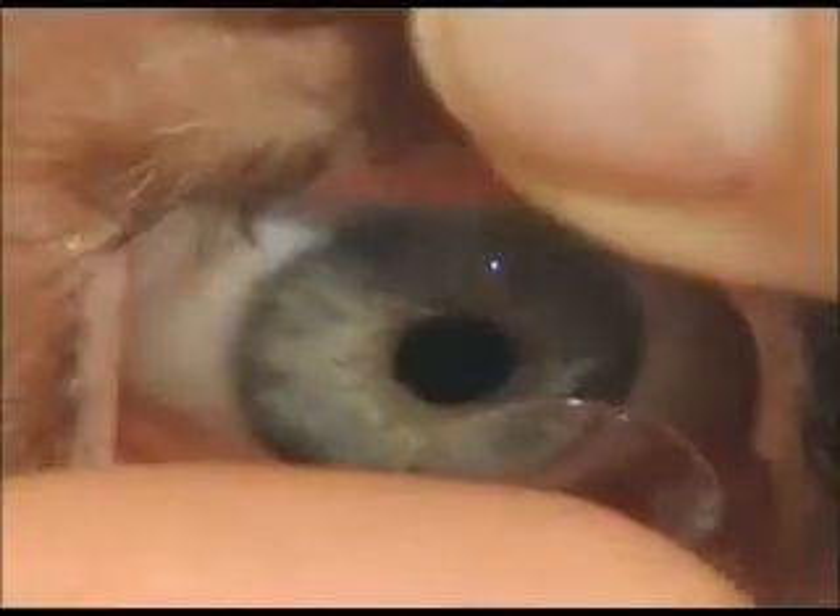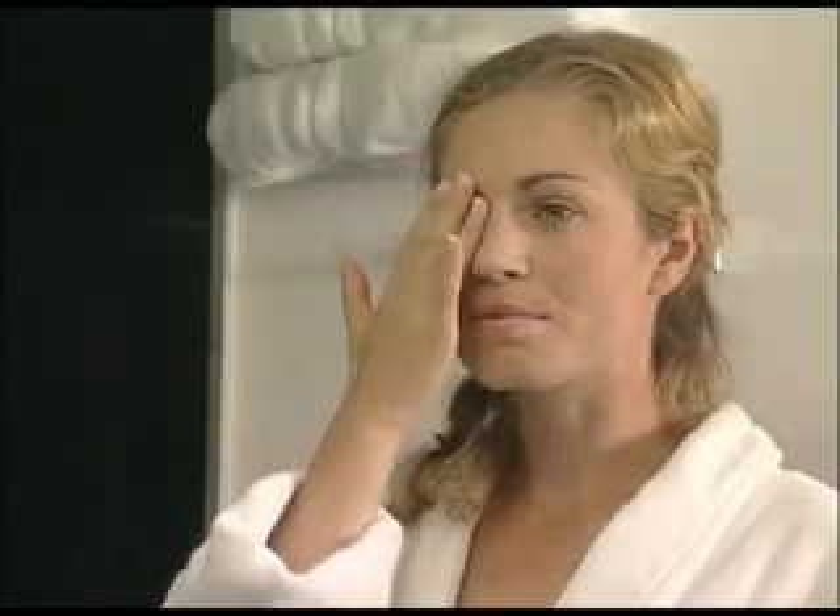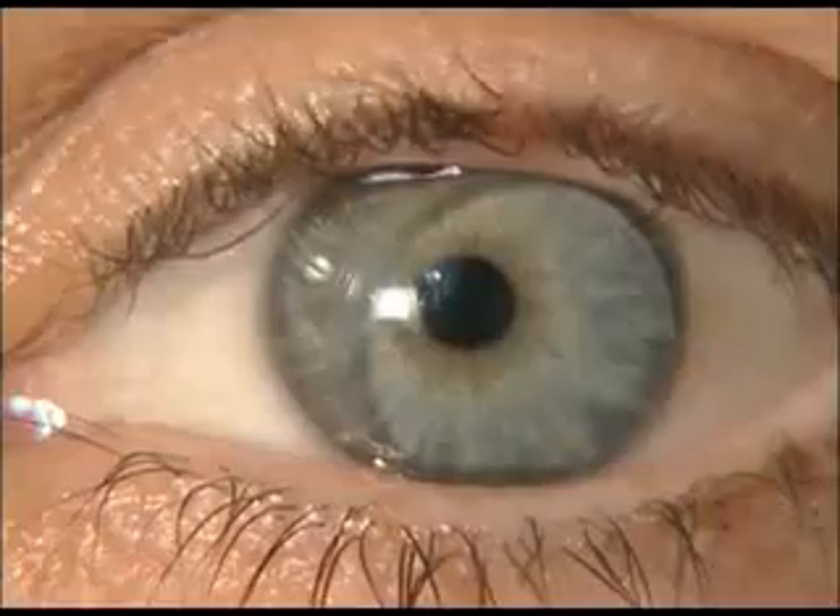With your right middle finger, lower the bottom eyelid. With your left index finger, lift the upper eyelid and place the lens on the cornea. Release the bottom eyelid and then gently release the upper one. Lift your head and check your vision by covering your other eye.